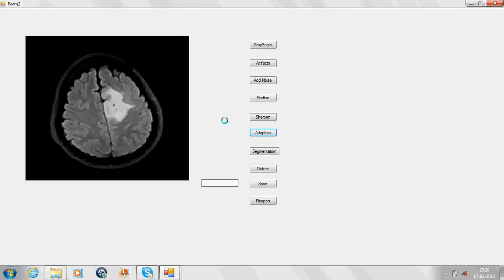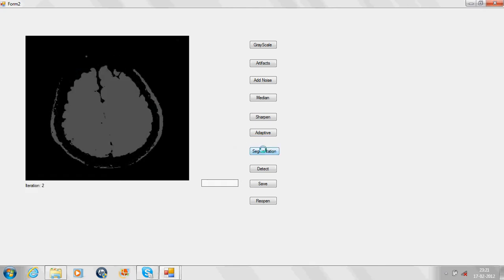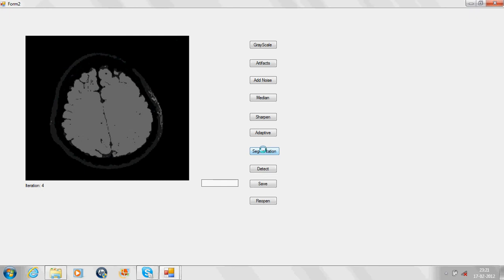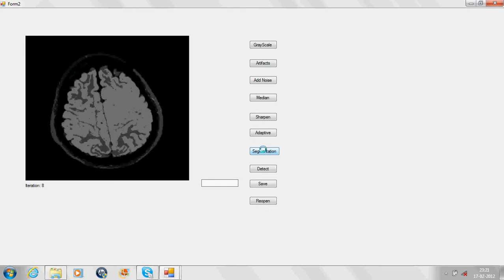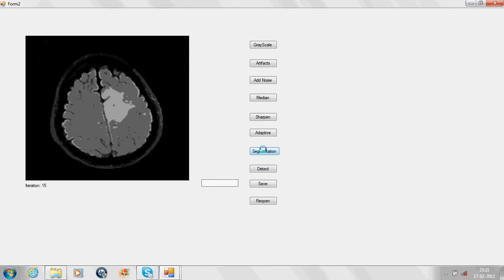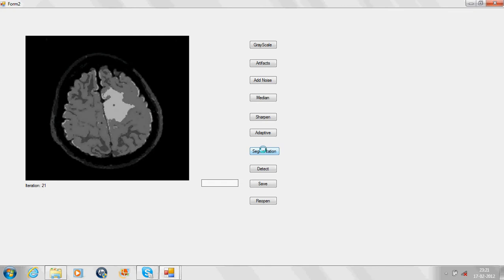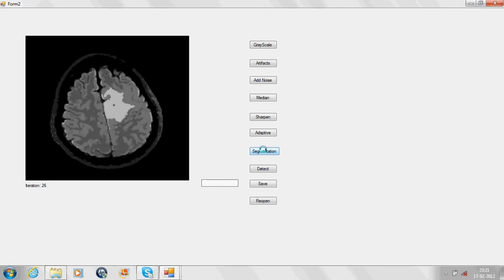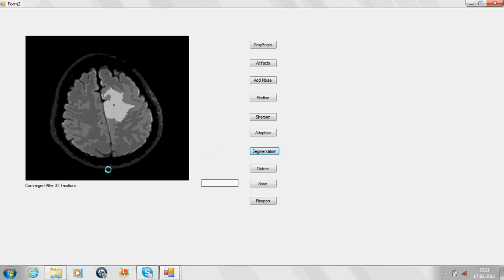The segmentation module deals with dividing the image into different homogeneous regions. For this, we have used fuzzy k-means clustering algorithm to get the precise and appropriate output. Now let us see the execution of the segmentation module. As you can see, the tissues are segmented into different homogeneous regions and it has converged after 32 iterations.